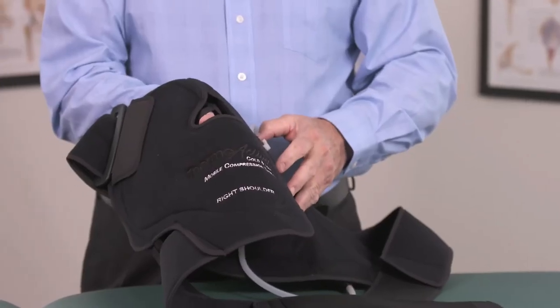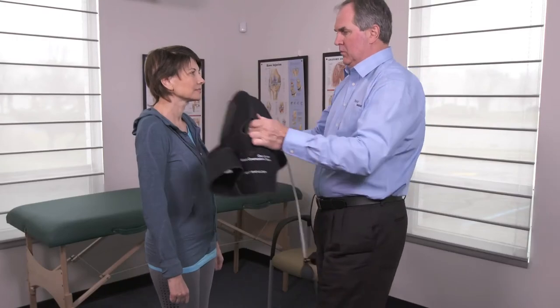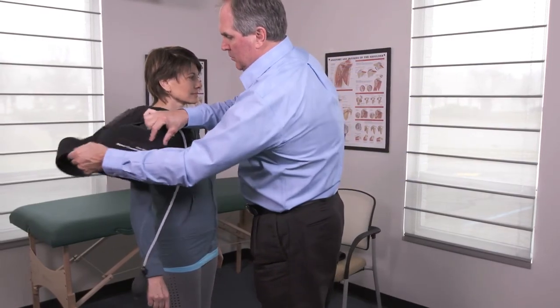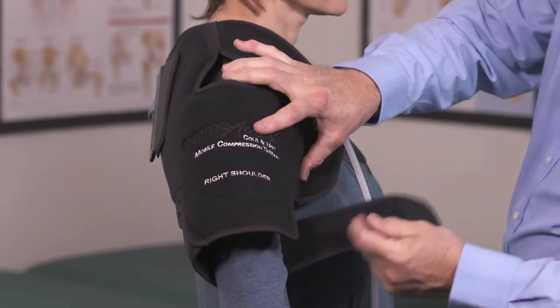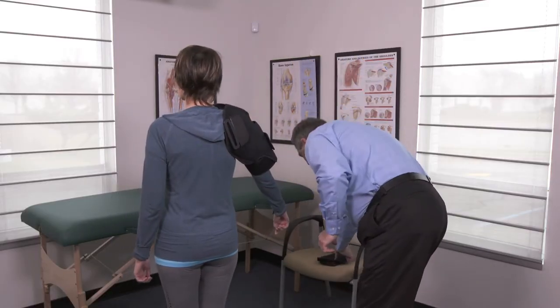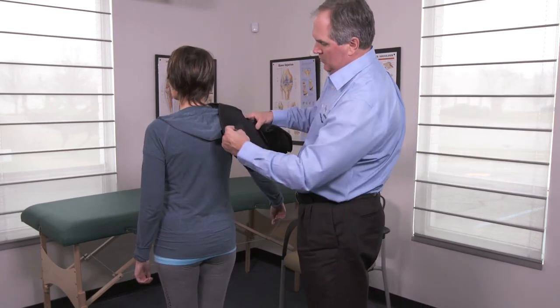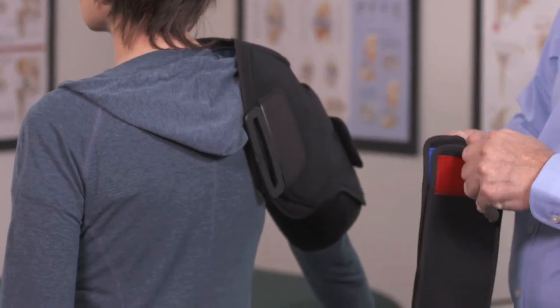This is our Thermoactive Medical shoulder system. The brace is placed on the patient's shoulder in a starting position. The Y-style arm strap is pulled around the arm and attached to the front — be sure the strap is snug to hold the brace in position. The floating D-ring can be moved in any direction to ensure the strap always lies flat against the body and holds the shoulder in an optimal position for recovery.